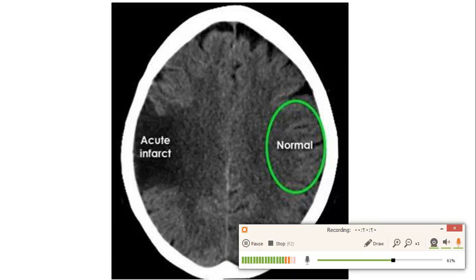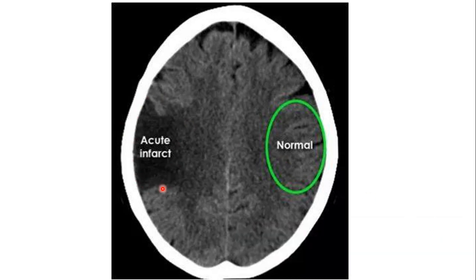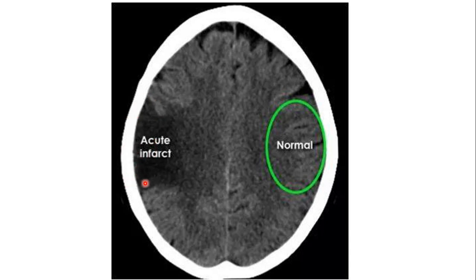Here we can see an acute infarction. How do we know it is acute and not chronic? There is edema — decreased density of the brain parenchyma due to fluid. The overlying sulci are effaced, not obvious compared to the other side where sulci are prominent and appear normal. This is an acute infarction at the distribution of the right middle cerebral artery.